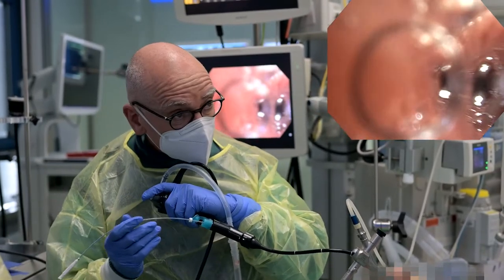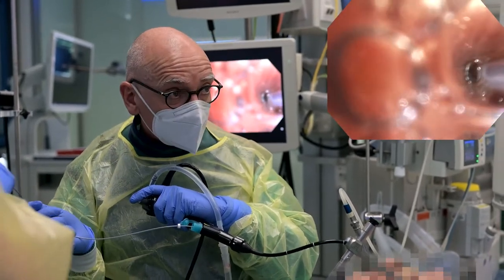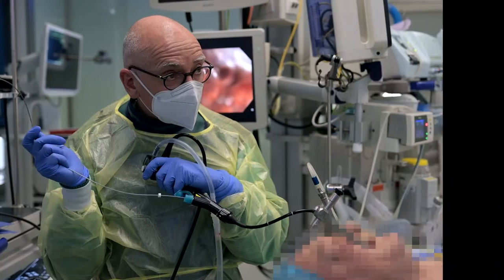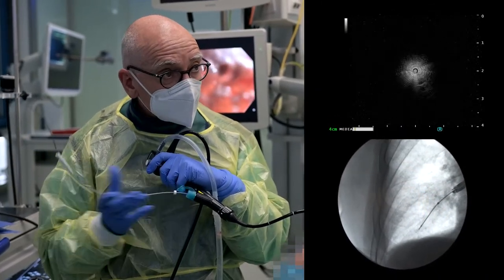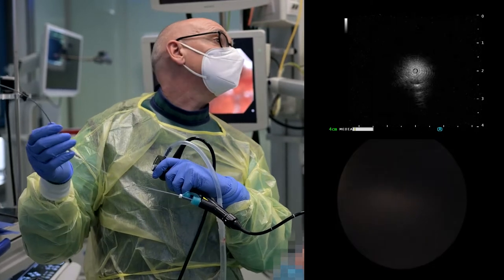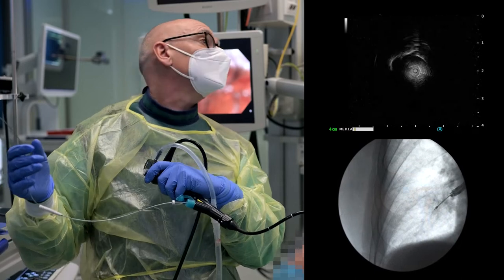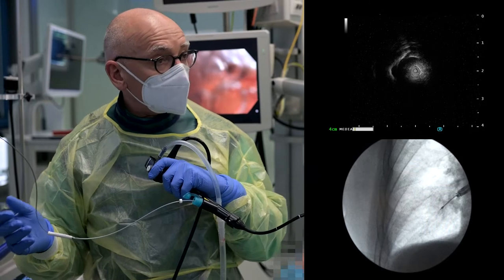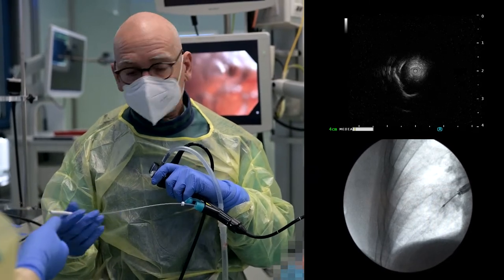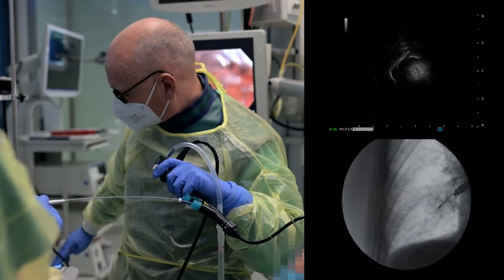The radial E-BUS probe is then extracted while keeping the guide sheath in place. This enables the bronchoscopist to use two fingers to hold the bronchoscope in place, preventing dislodgement of the sheath. This method can be particularly helpful for lesions that are barely visible under fluoroscopy, such as ground-glass opacity lesions, small nodules, or lesions located in the beam path along with other dense structures.